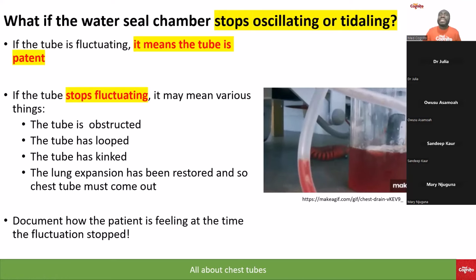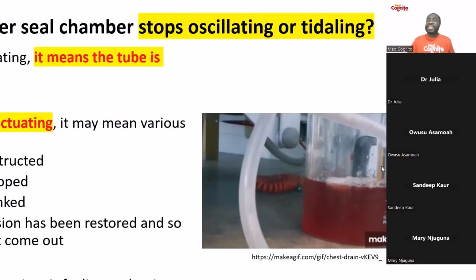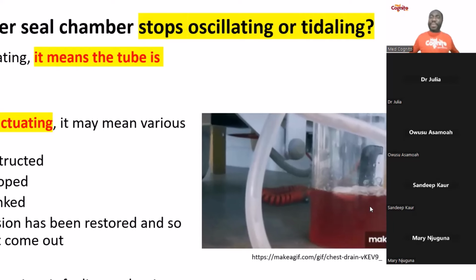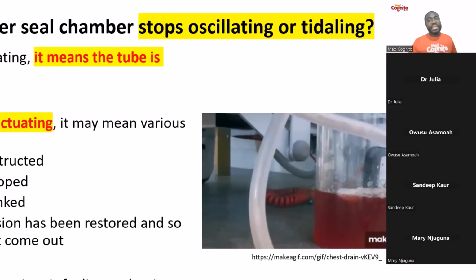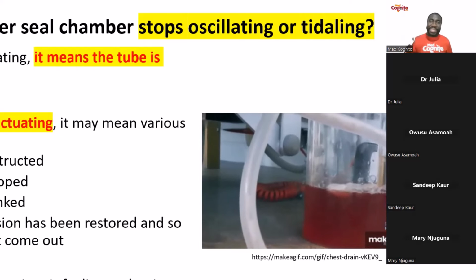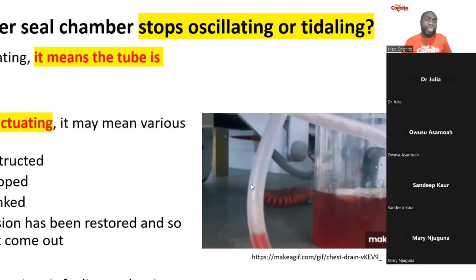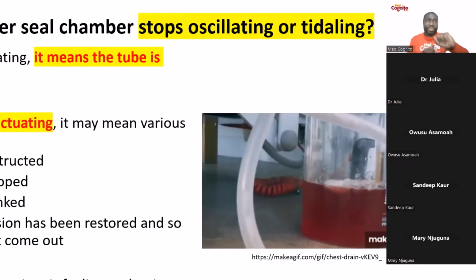So the question is very simple. What if the water seal stops oscillating? Somebody may be asking me, what do you mean by oscillation? This is what is happening. This is oscillation. Are you seeing it? As a patient is breathing in and out, you see? This is all that oscillation is all about. So those who are asking about oscillation, and then those who are asking about kinking. Kinking is when this tube turns on itself.